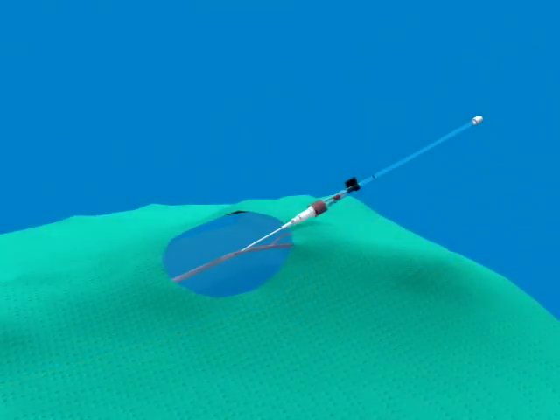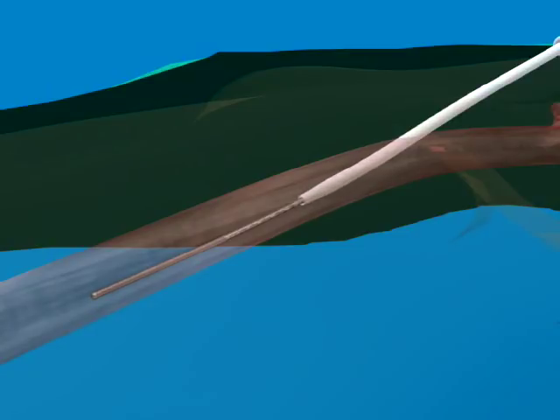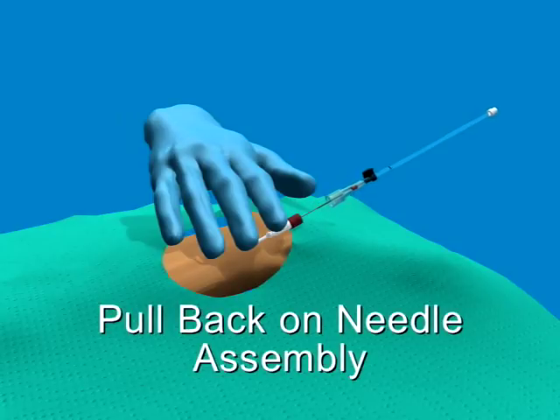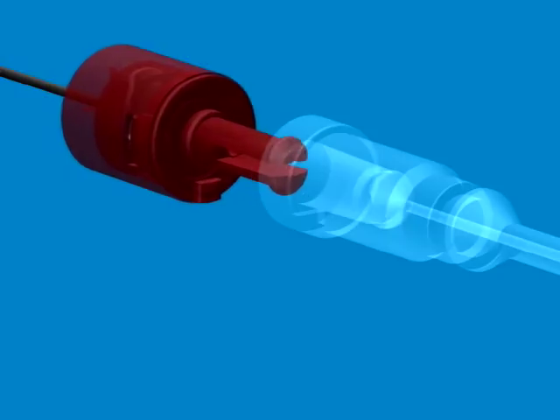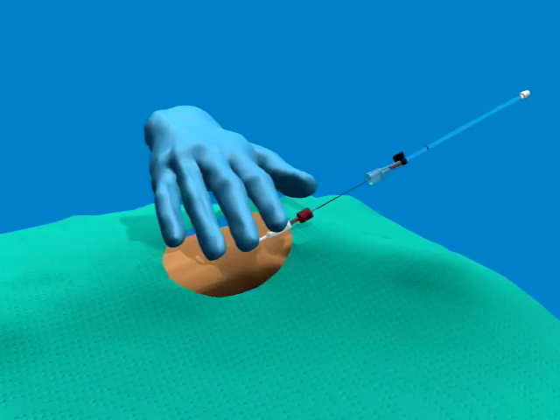While holding the introducer needle hub — the clear hub that covers the red safety hub — advance the catheter over the spring wire guide. As the catheter advances, the red needle protection cap will follow and will remain locked onto the catheter hub until the needle enters the protection device. Secure the catheter hub and continue to pull the needle hub. The needle tip will be locked into the protective assembly when the needle is pulled out of the catheter hub. As soon as the needle is protected, the red cap can be separated from the catheter hub. A small amount of resistance can be felt as the safety device separates from the catheter hub; therefore, you should adjust your grip on the catheter to prevent the catheter from pulling out of the insertion site.